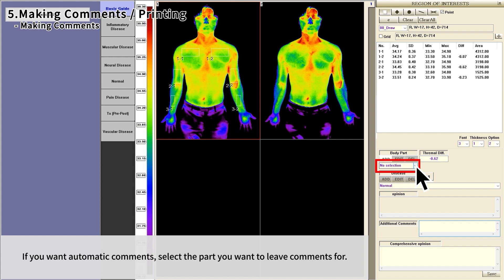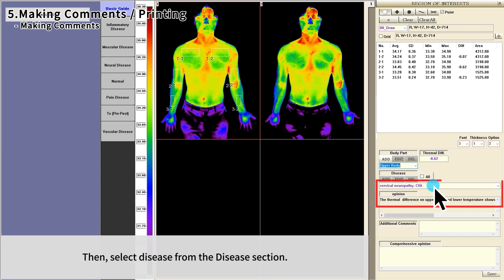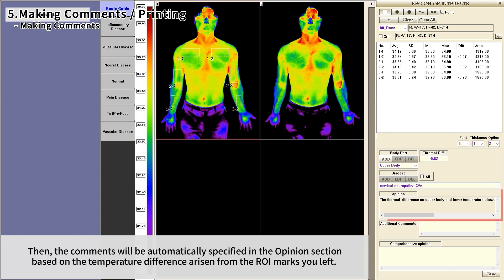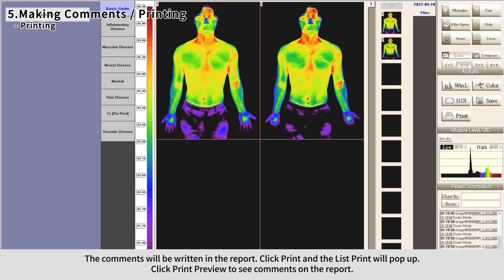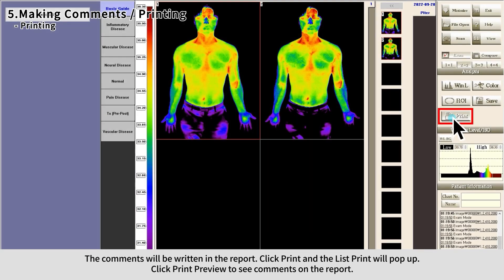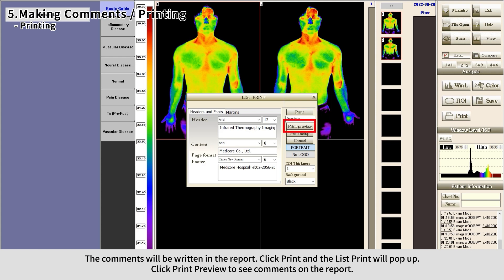For automatic comments, select the body part you want to leave comments for, then select a disease from the disease section. Comments will be automatically generated in the opinion section based on the temperature difference from the ROI marks you placed. To receive correct comments, the accurate poses and ROI marks recommended in the guideline must be followed. The comments will be written in the report — click Print and the list print window will pop up. Click Print Preview to see the comments on the report.